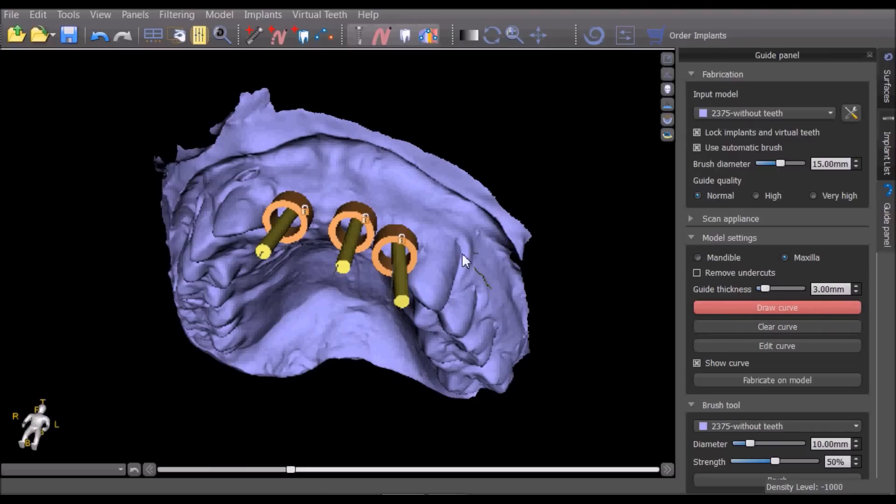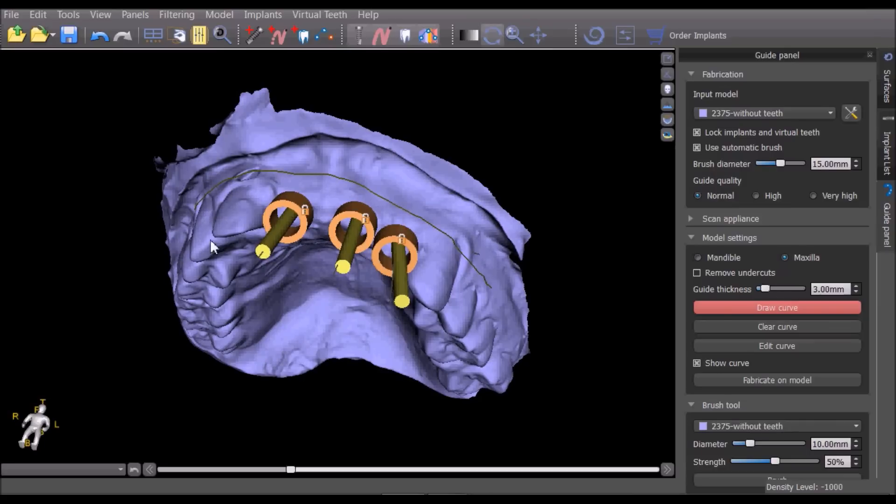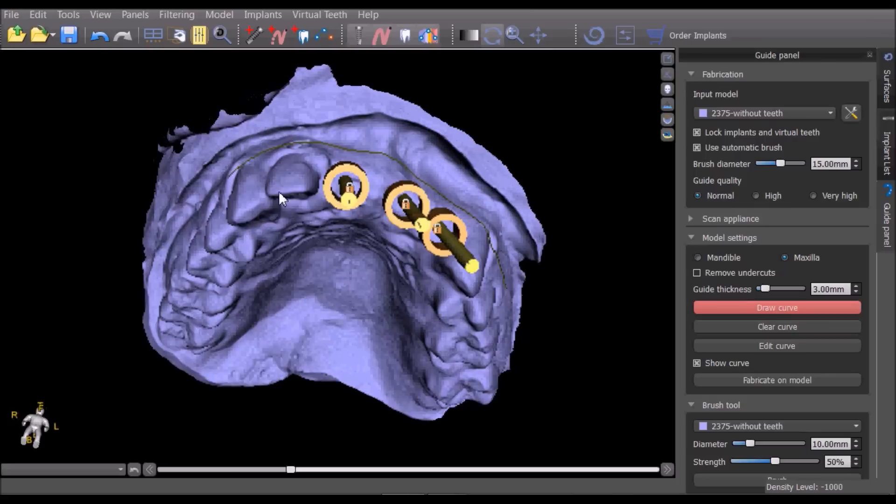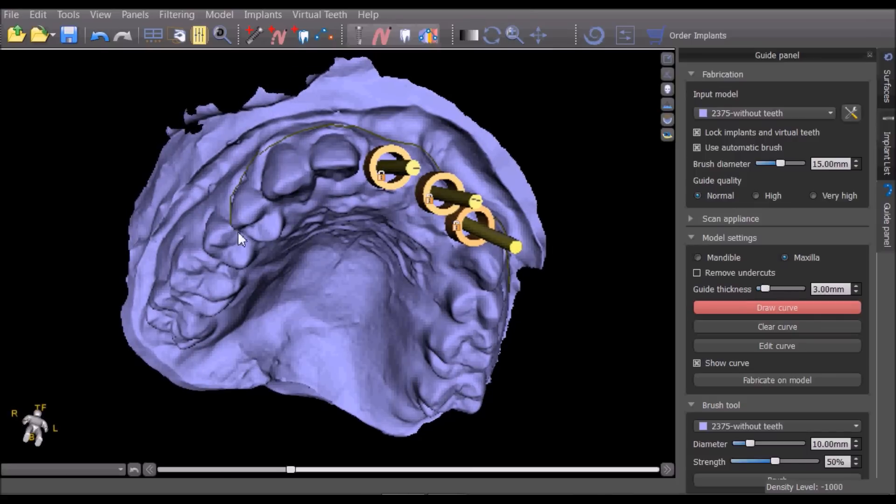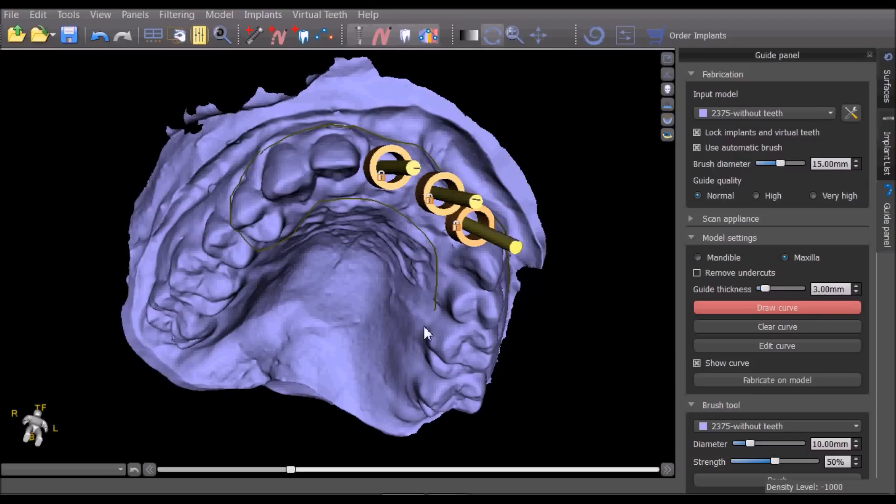Holding down the shift key and using the left mouse button, the curve can be drawn representing the area on which the surgical guide will be fabricated. Releasing the shift key will once again return the normal functionality to the left mouse button and allow you to rotate the model.